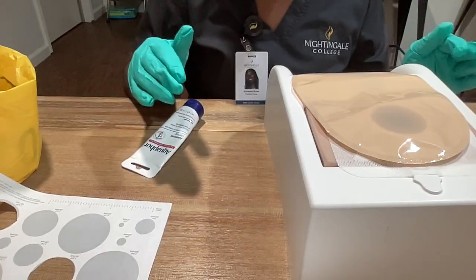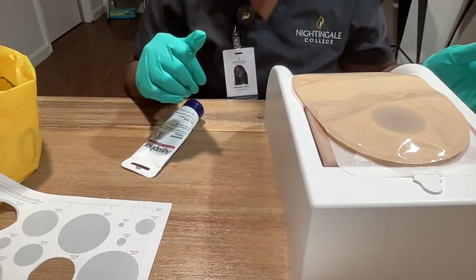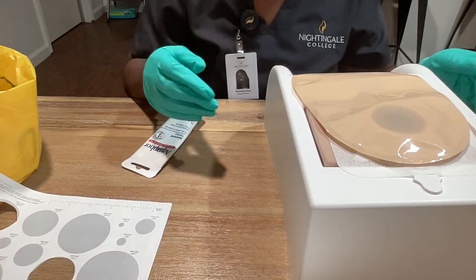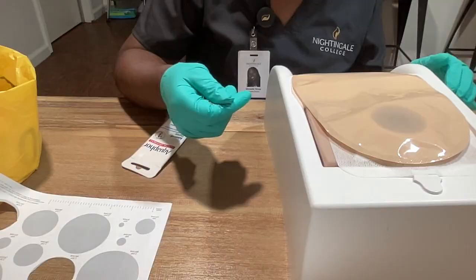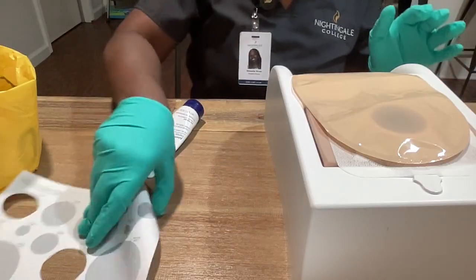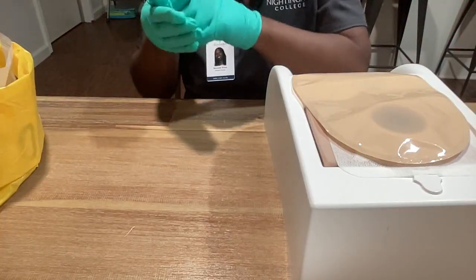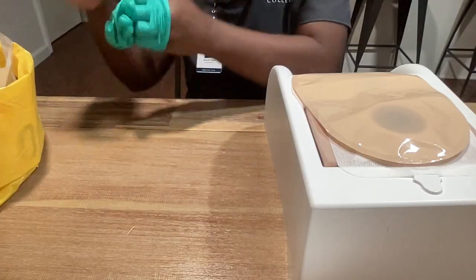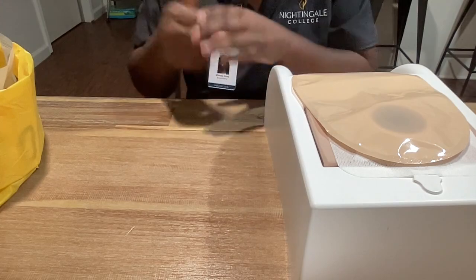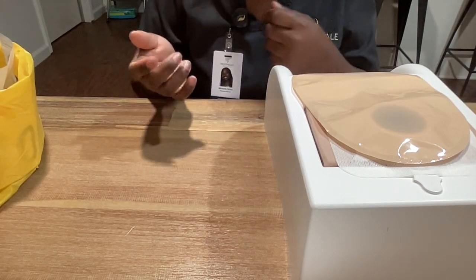Ms. Jones, how are you feeling? Is everything okay? Are you comfortable or would you like to be raised up a little more or laid down? You're in a comfortable position — here's your call light. If you need anything, please let us know. I will make sure that I'm leaving the area clean. I will remove my gloves, perform hand hygiene, and go document this procedure and report any concerns to the doctor.